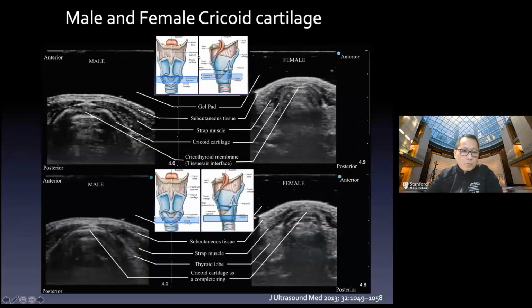As I mentioned, we have a beautiful picture we can see, but just like when we first started doing ultrasound for regional block, sometimes you get a good image, and that doesn't mean you can put the needle through. When you put the ultrasound probe, you need a lot of gel, and your probe will cover the needle entry point, which is a meticulous, small area to go through. It's almost like trying to do a thoracic epidural directly guided with ultrasound. Same problem again.